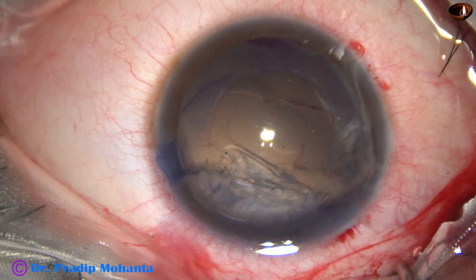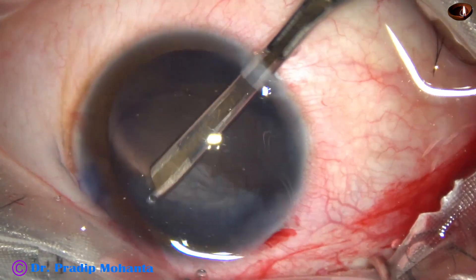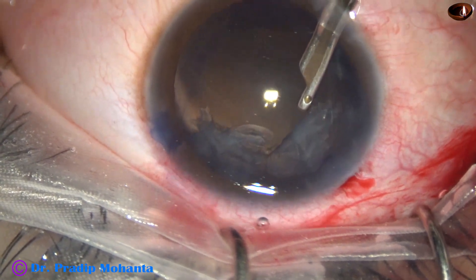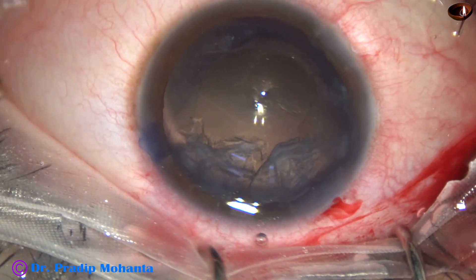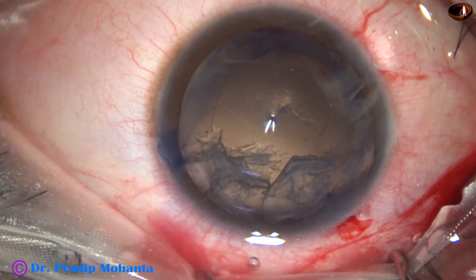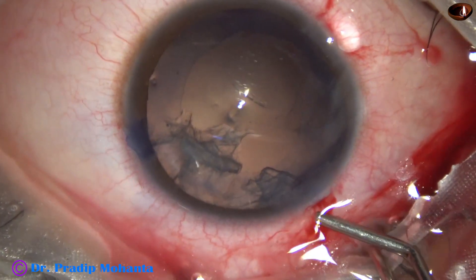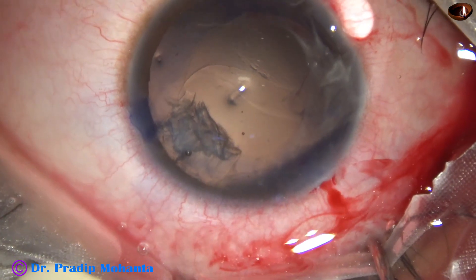I made a side port at 7 o'clock. With low flow, I go with the Simcoe cannula and aspirate the cortex. Looking at the cortex from 12 o'clock, some fibers are caught and there is a rent — we can see a round opening. Inferiorly, there is rupture of the anterior hyaloid. I inject some more viscoelastic inferiorly and the cortex comes out. We just have to remove this cortex at 1 o'clock.